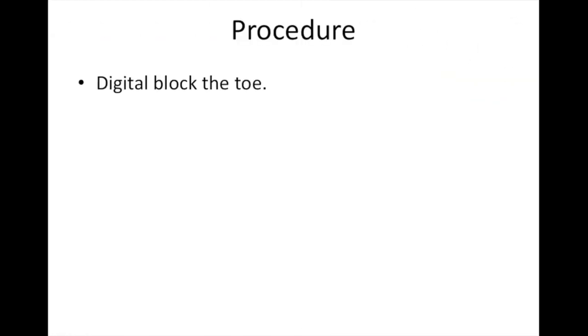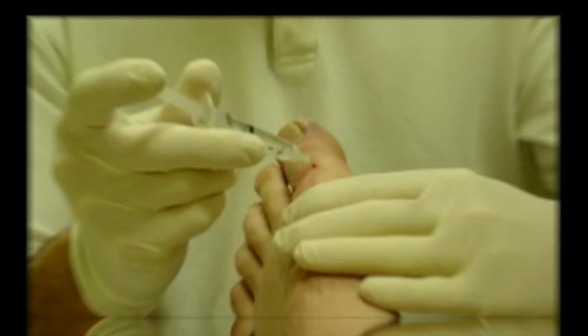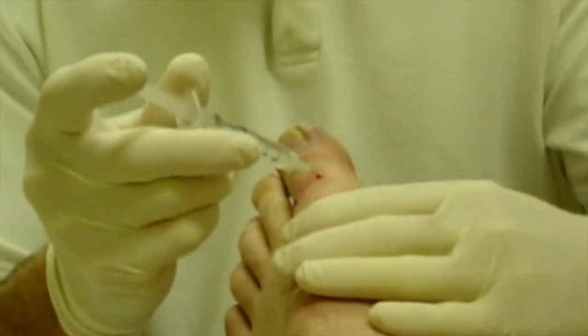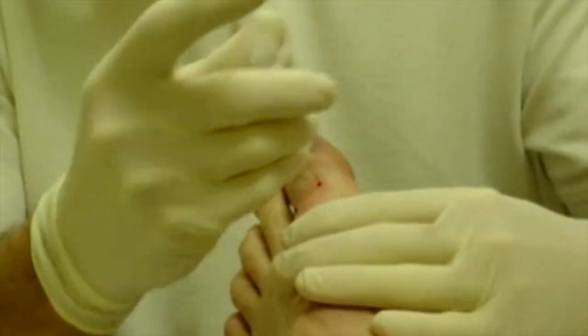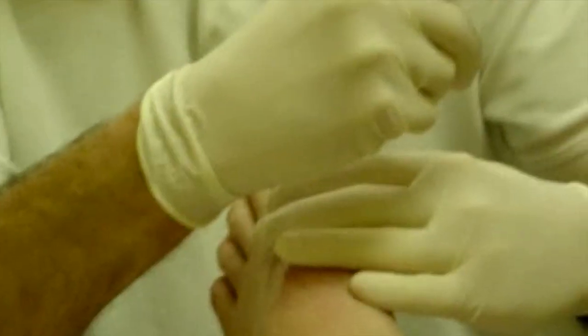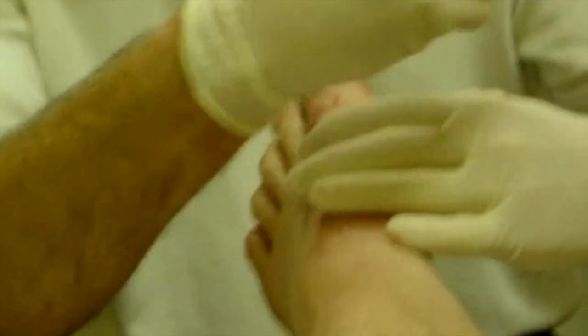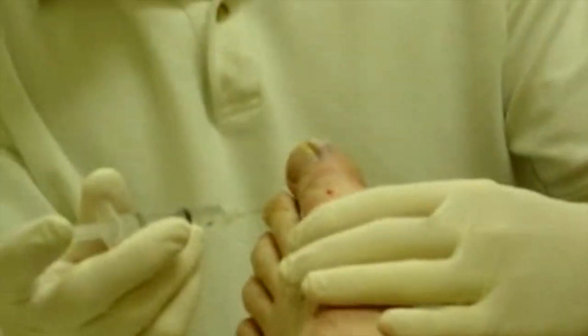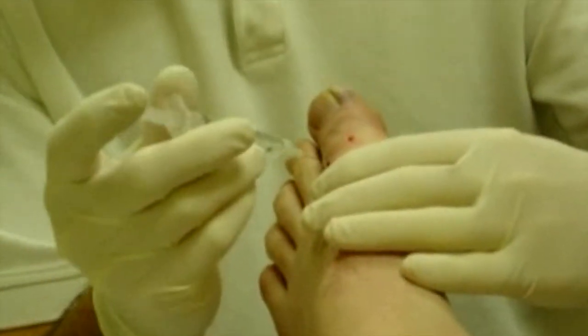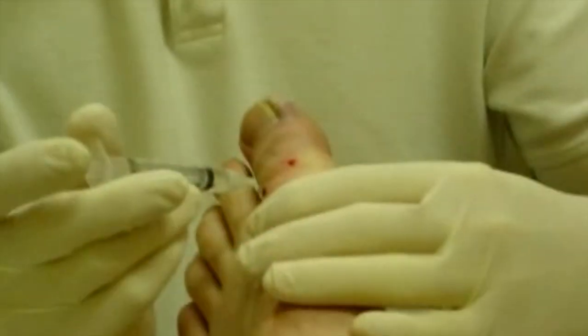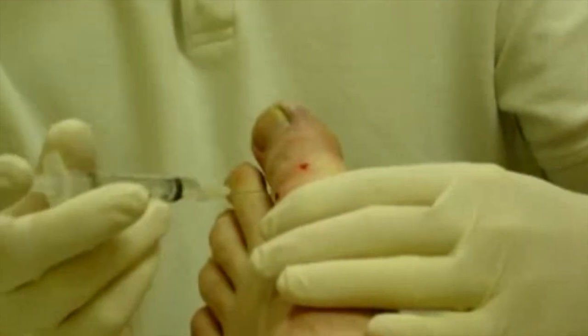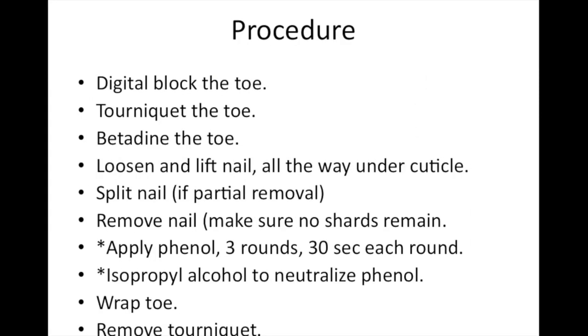For the procedure itself, first we want to do our digital block. Prep the toe, then do the block. The doctor first injected along the medial aspect of the toe, then the dorsal, and then the lateral. Let's put this all together to see what it looks like.